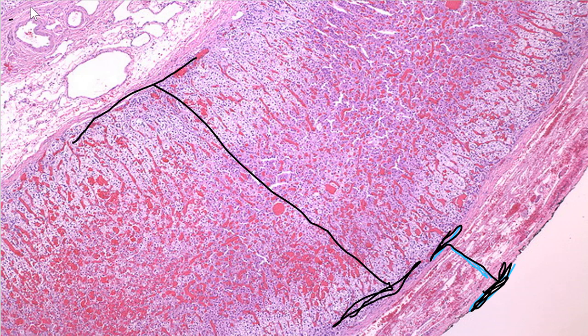And then here, and this is not the whole thing, but just a little portion of it, there's our medulla.